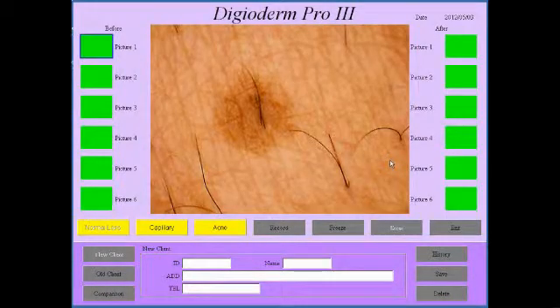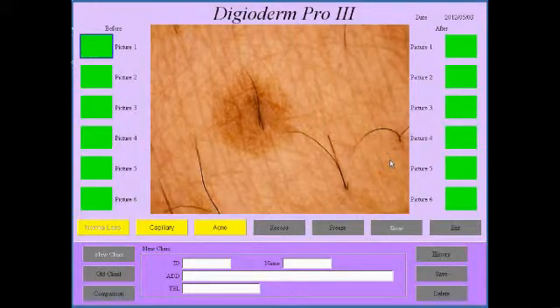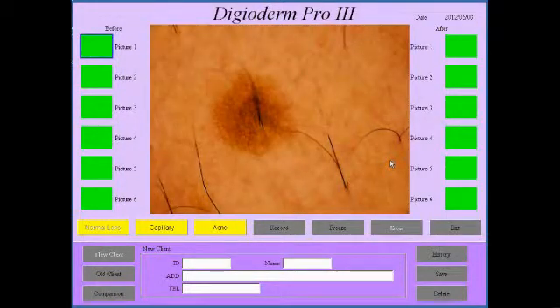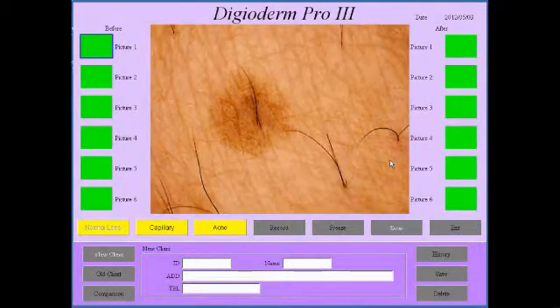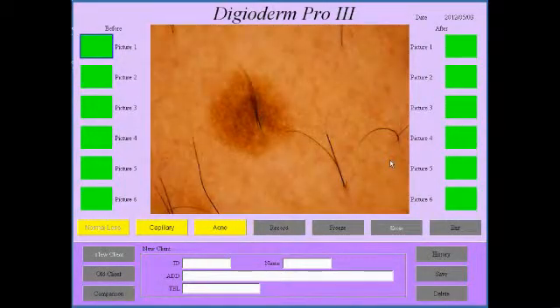And you can straight away see the detail there on the pigmentation network. If I switch to normal, that is what the little spot looks like. You can also adjust the brightness, the contrast, the hue to get the colors just right for yourself, because colors are very important in the diagnosis of skin cancer.